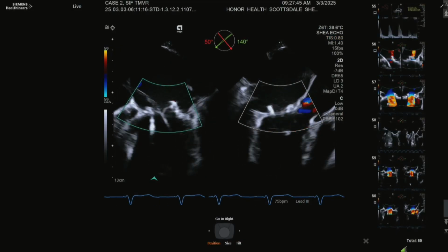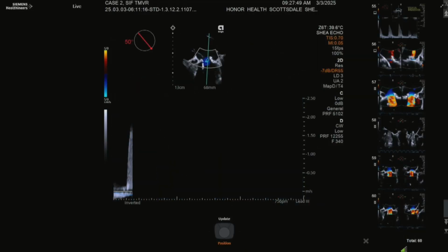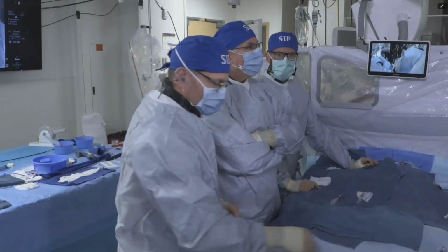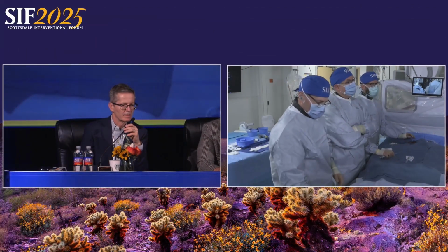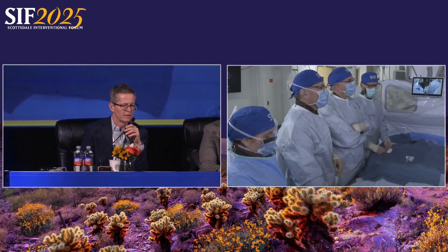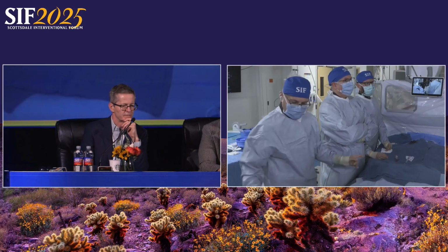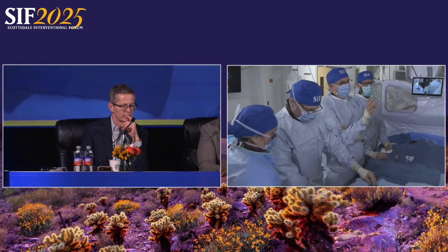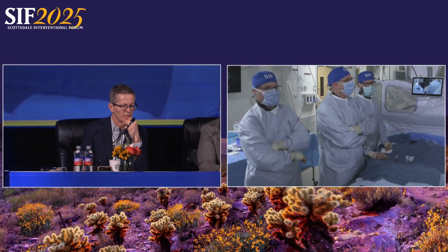All right, we'll let you guys go next door to look at the appendage. But thanks for indulging us. It's a tricky case. I'm glad we were able to give this woman hopefully some benefit for a couple of years and maybe longer. Once we pull it, we'll keep everything in the atrium and just make sure that it looks as good as we want and the gradient is as good. And if not, we'll come back and decide to use a true balloon to further dilate it. But thank you, everybody.